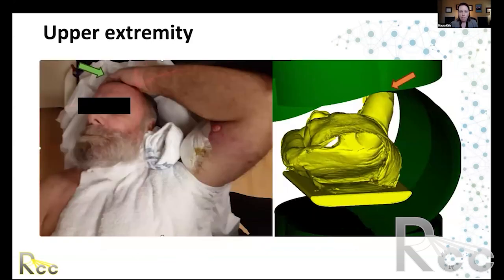And Justin brought up this idea earlier, how we have to be cautious of clearance when we have the elbows high or the patient angled high on the couch. We always have to keep in mind that we have to be able to get the gantry around the patient. So here's a patient being treated to their upper extremity. Some things that become important are separation between the target and other normal tissues like the head, putting something in between there. It looks like there's maybe a custom cushion here to reproducibly position where this patient's wrist is, which will help stabilize the angle of the arm. And then this looks like a 3D simulation.